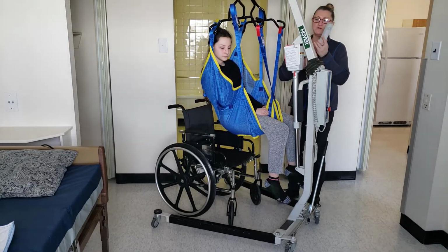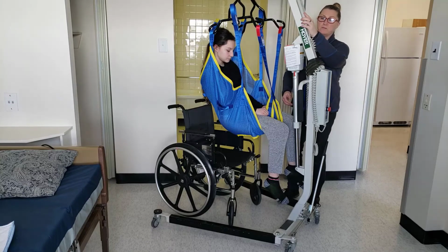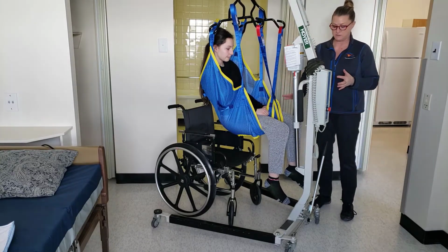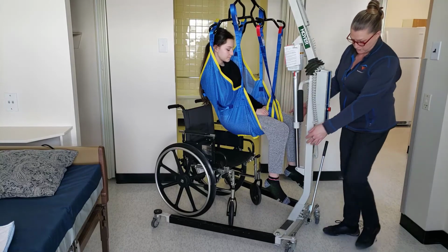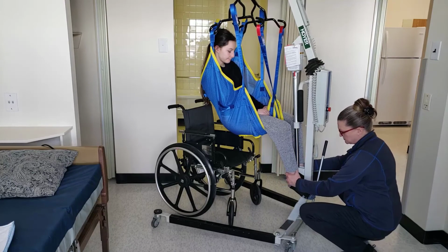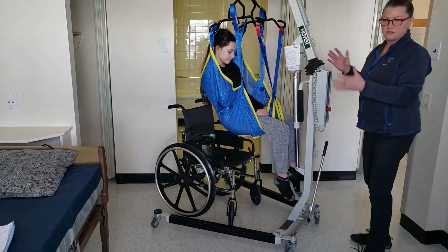As you're maneuvering the Hoyer lift to either the bed or the commode, you just want to make sure that the tenant isn't swinging around, making sure that their feet are either side of the mast. The tenant might be able to hold the mast, or they just lay there, and you just want to make sure that they're not swinging.